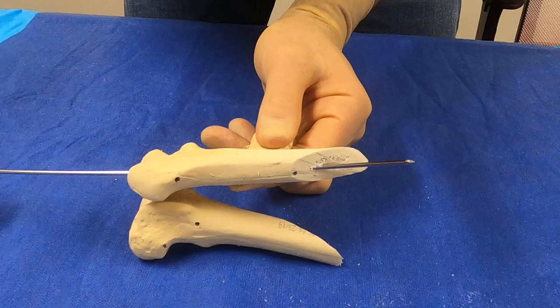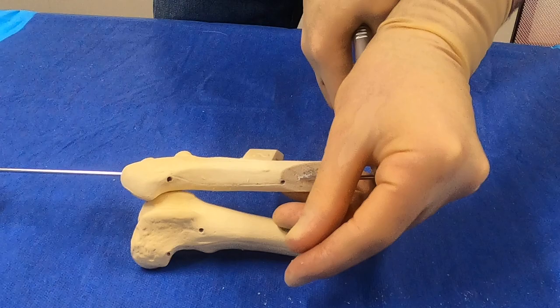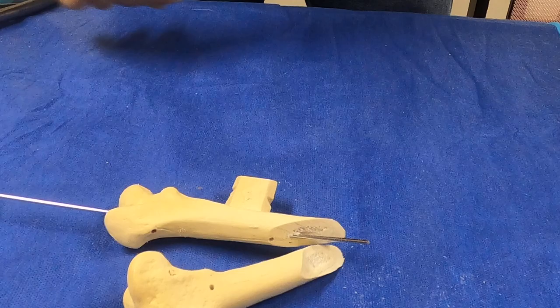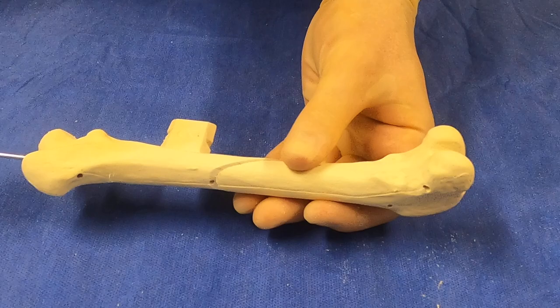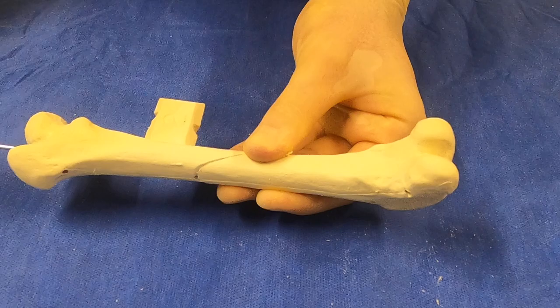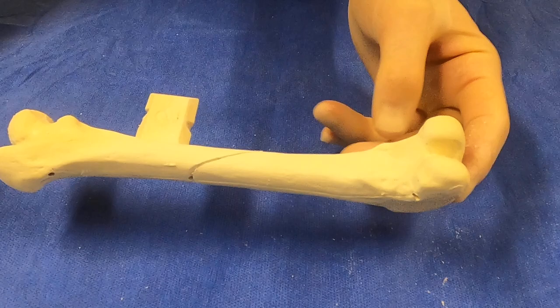If we were going to reduce the fracture and place this, what I would normally do is blunt the end of the tip — so we'd cut it. We blunt the end, then take it back up to the fracture line, reduce the fracture, and continue to place the IM pin until we feel it engage the distal cortex.